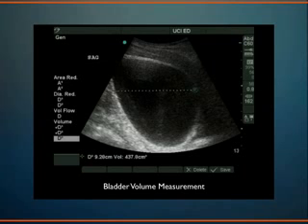Okay, so that's it, and also to see how well the kidneys are functioning. We can look at the bladder to assess jets and stuff. There's a whole host of things I can see in the bladder: diverticulums, bladder tumors and masses, and thickening of the bladder wall consistent with cystitis. But just to measure the urine, there's also something called a post-void residual. Somebody who has an enlarged prostate thinks they've emptied their bladder, but instead we have 400 cc's left in the bladder after somebody attempts to void their bladder.